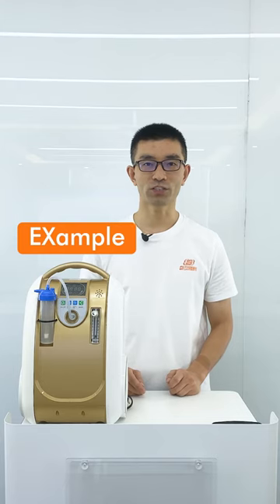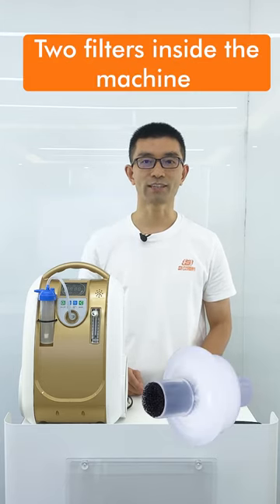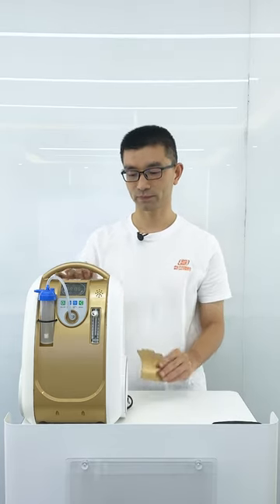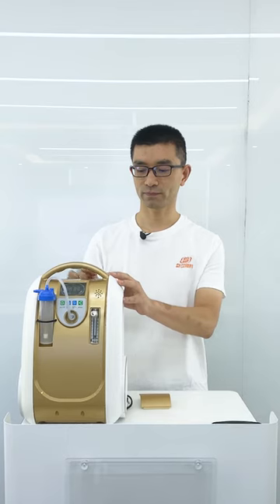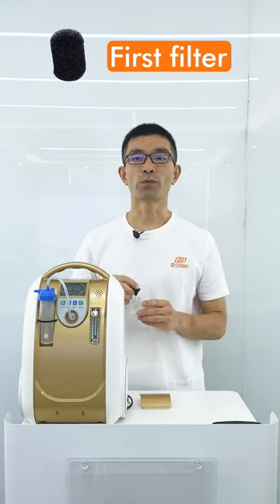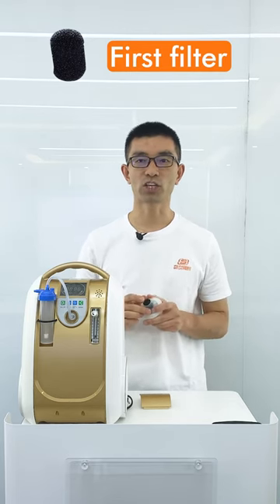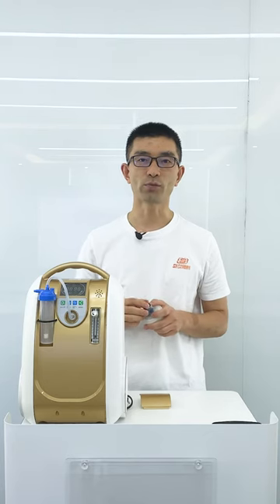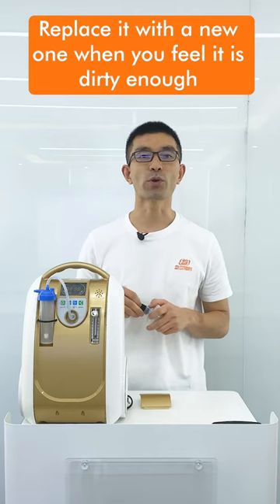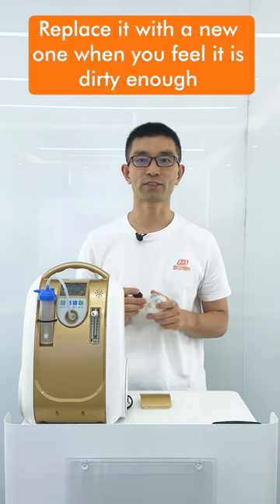Take the Olive oxygen concentrator as an example. There are two filters inside the machine. This is the first filter, which prevents dust from entering the oxygen concentrator when it is running. We recommend cleaning it once a week, and replacing it with a new one when it feels dirty enough, after three to six months of use.